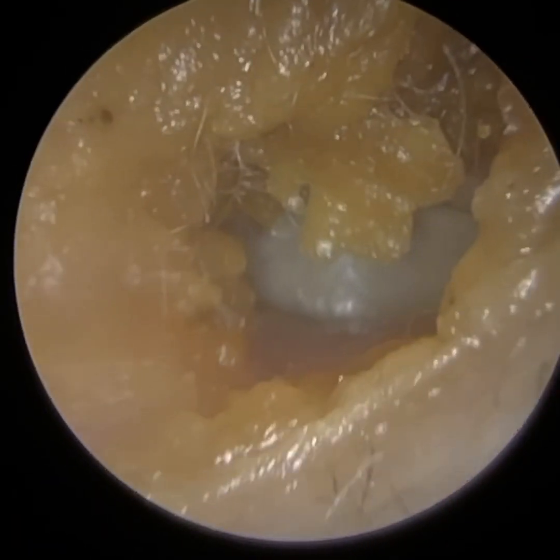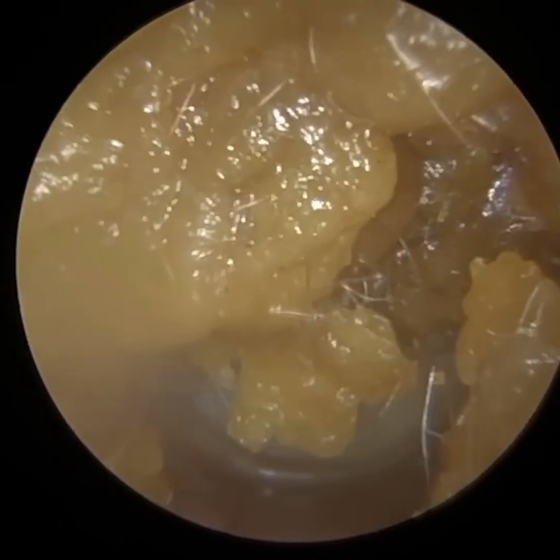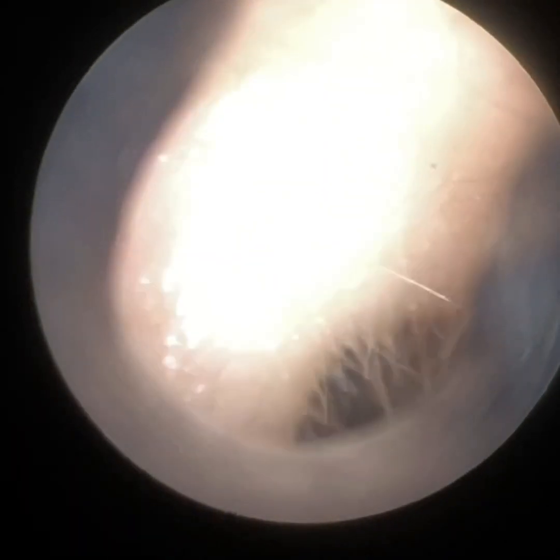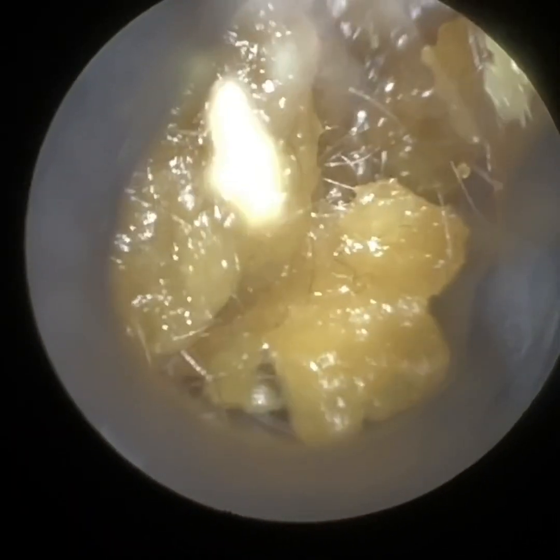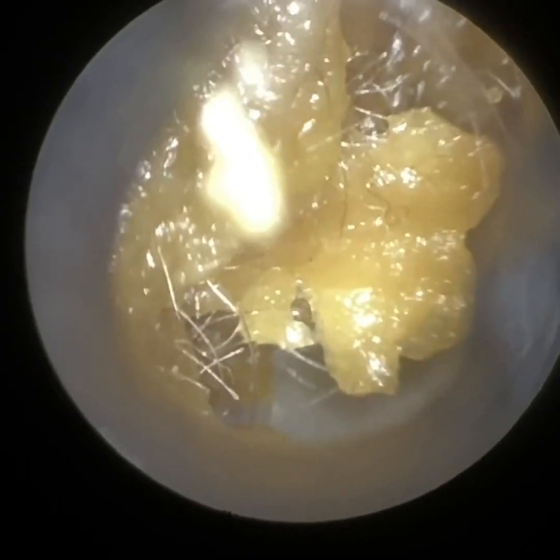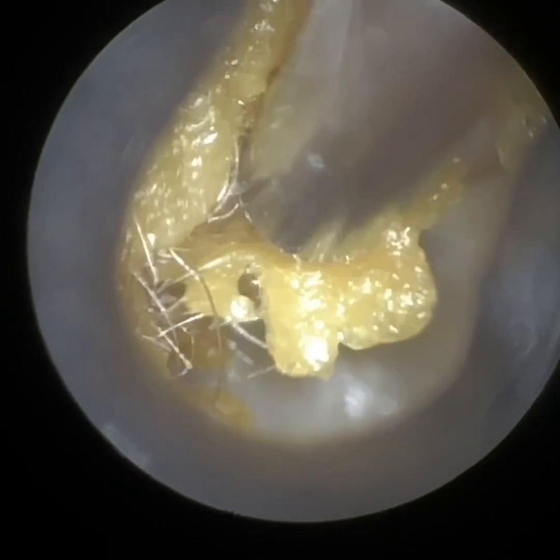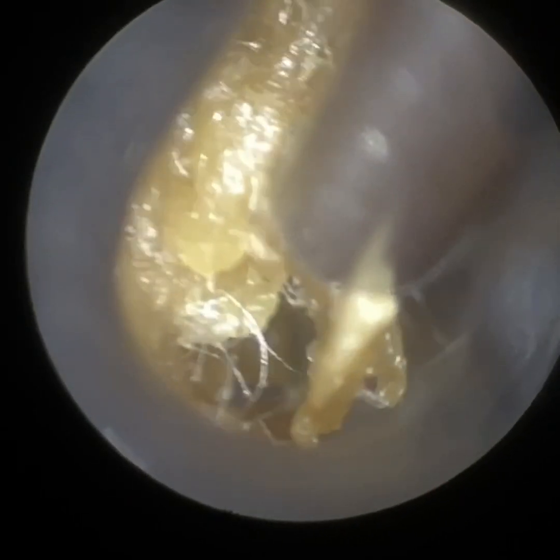Hi everyone, this is Mr. Neil Reiteter, consultant audiologist and director of Clearwax. Thank you for joining me in another demonstration video of our recently developed WaxScope, which is due to be launched in the next month or two. So if you are interested, please do email info at clearwax.co.uk.